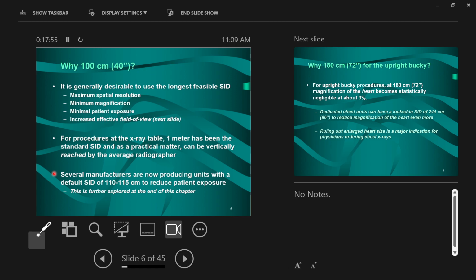But if it doesn't, like if it's fixed like this one, then maybe you have a stool to step on. That's what we actually did for that student. We brought a stool in, and I started having her stand on a stool, and then we were like, wait, let's be smarter than this. Let's just lower the table and the tube together. And we made new marks on the wall and on the table where her distances are so that she can keep her SID fixed, but have everything in the room be lowered to her height to be workable for her.